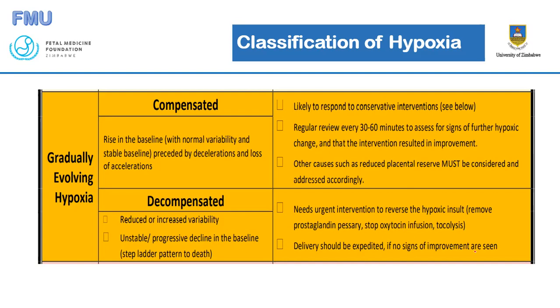Baseline in terms of neonatal outcome, the bad neonatal outcome, we have a very high baseline, which is different from countries with a very low baseline. So if CTG is to be tested in countries with a very low baseline, the changes are going to be very tiny because everything else is being done properly. But in our case, with MSBs and FSBs, actually FSBs are being mislabeled as MSBs because there's just too much death of babies. Personally, I think we are going to get some benefit in monitoring these women.